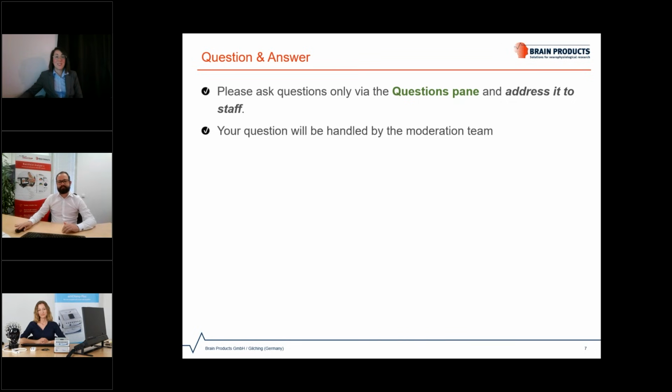Perfect. Thank you so much for your very detailed answer. Laura, I have another question for you, and it's about the BrainAmp DC and if it can be used with eye tracking.